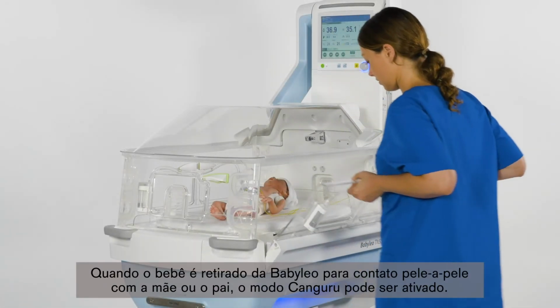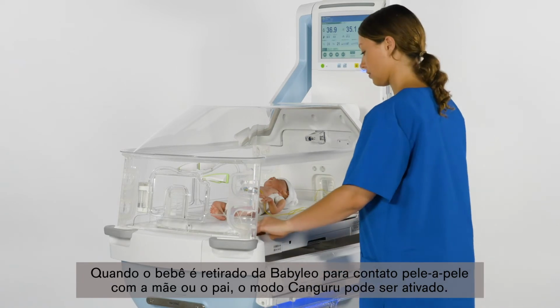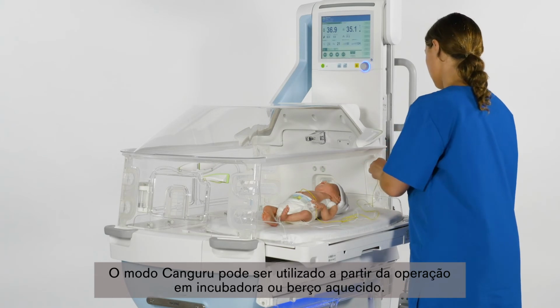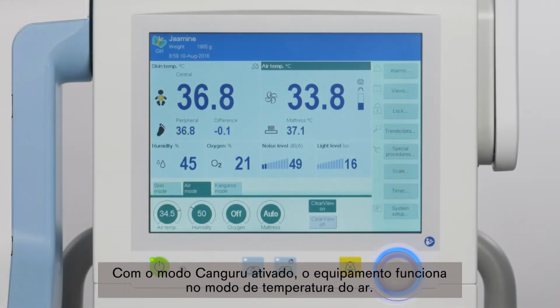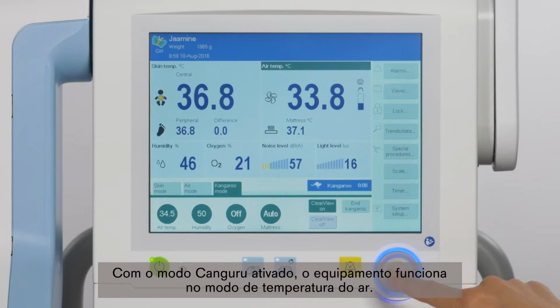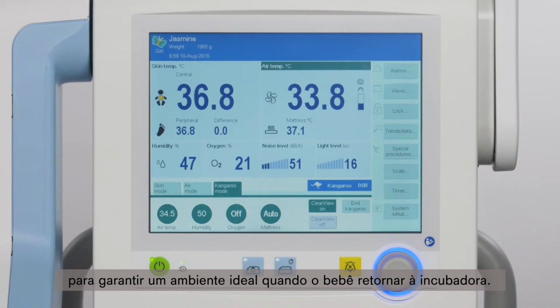When the baby is taken out from baby Leo for skin-to-skin care with mum or dad, the Kangaroo Mode can be activated. Kangaroo Mode can be used during incubator operation and radiant warmer operation. Once Kangaroo Mode has been activated, the device is operated in air temperature mode. The settings for air temperature, humidity, oxygen, and mattress are adopted from the previously set therapy parameters to ensure an ideal environment when the infant is returned.